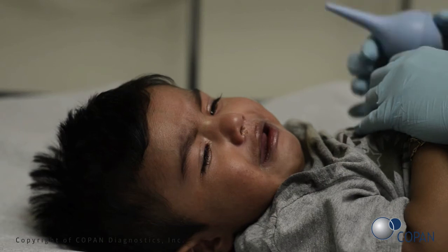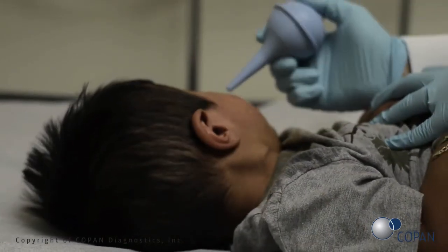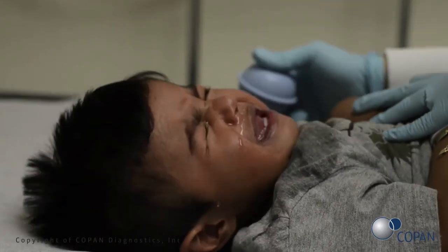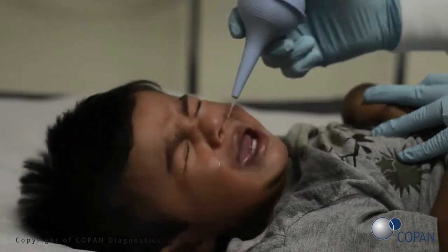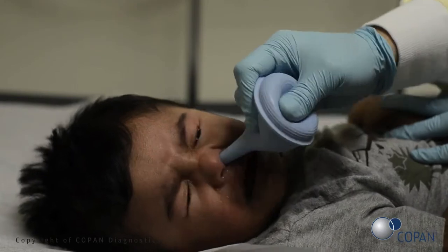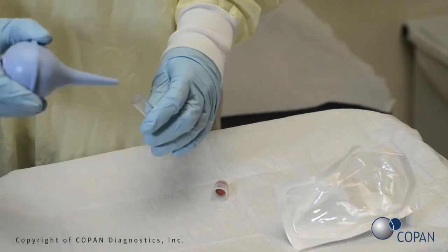Insert the tip of the bulb into the nostril and dispel saline into the child's nostril. If an obstruction is encountered, try the other nostril. Using a smooth motion, gently squeeze the bulb in order to expel and aspirate the saline. Carefully remove the tip of the bulb from the nose. Perform the test according to the manufacturer's instructions.